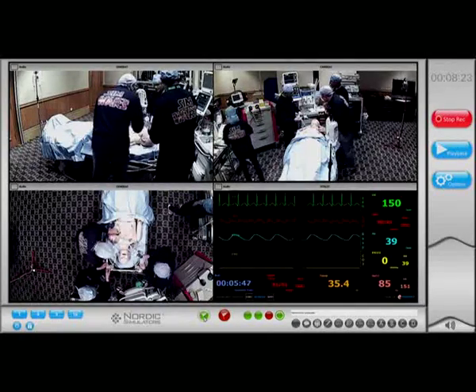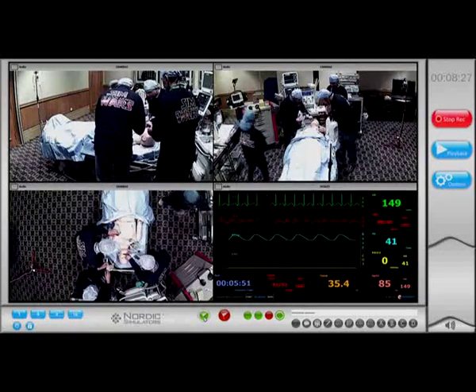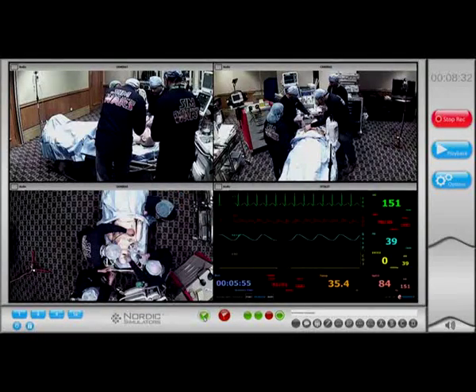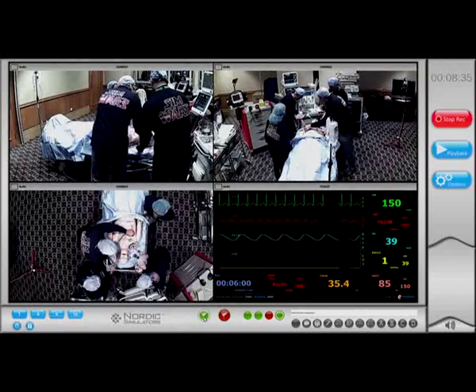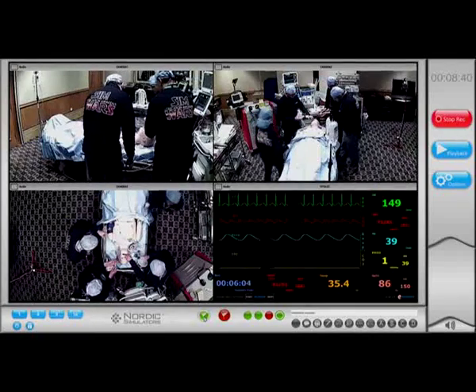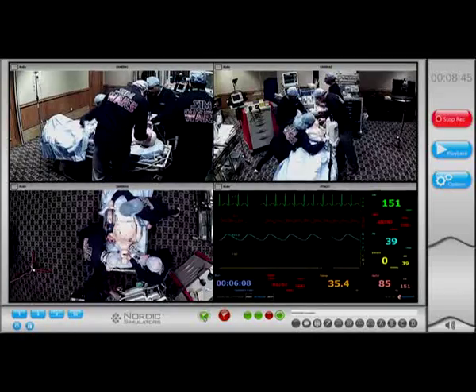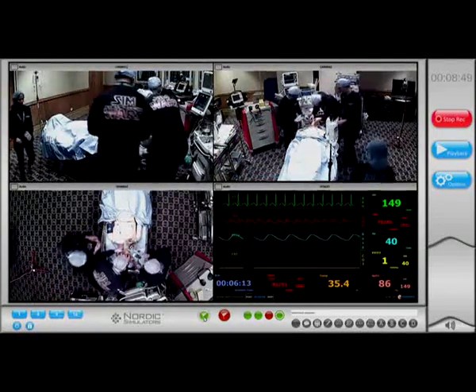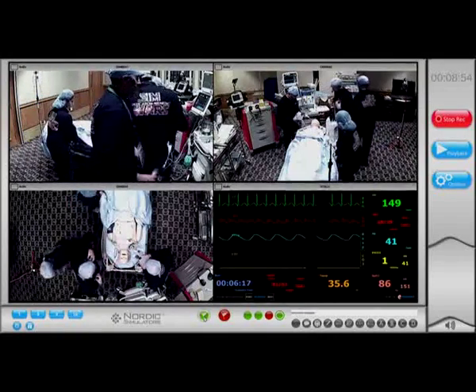No, saturation is going down. Check the airway again? No. Just check the tube. I wonder if it slipped. The tube is in, Dr. Laji. But there's no air, there's no ventilation.